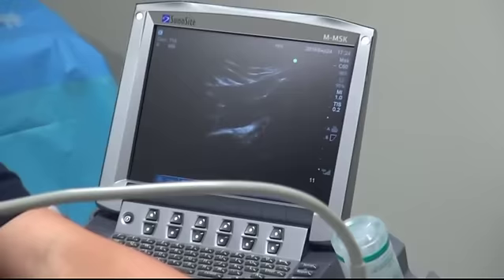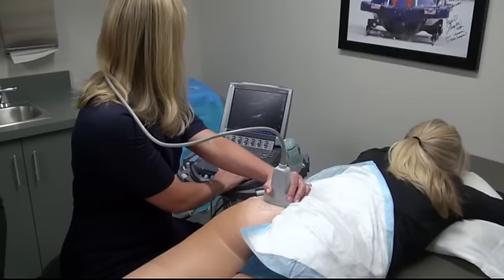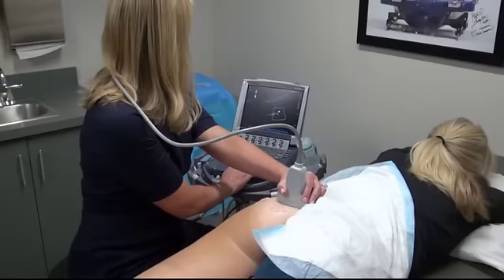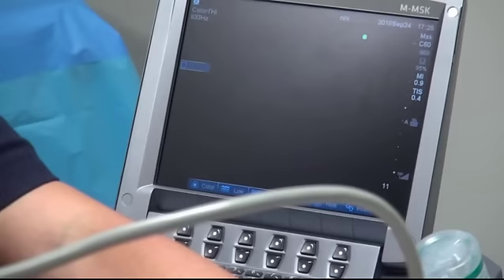It is helpful to have the procedural assistant rotate the lower extremity while the provider visualizes the movement and makes any adjustments to the ultrasound settings to best visualize the anatomic structures and injection. During the survey scan, Doppler imaging can be used to locate neurovascular structures to be avoided during the injection. The sciatic nerve can typically be visualized as the hyperechoic structure deep to the piriformis. At times, the sciatic nerve may be bifurcated with a portion of the nerve running through the musculature.